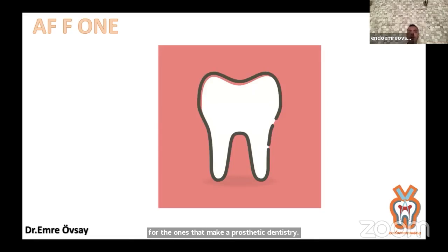So they broke the lentulo inside the root canal, and a prosthetic assistant came to me and asked what we will do. For basic endodontics and basic application, we always used an H-file to remove the helicoidal lentulo from the root canal.